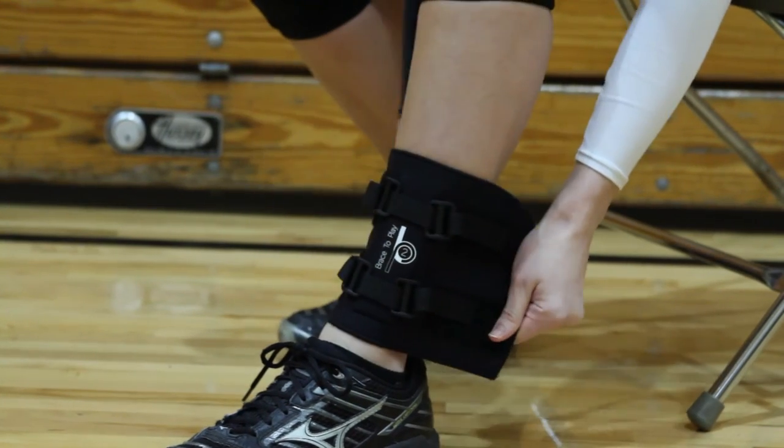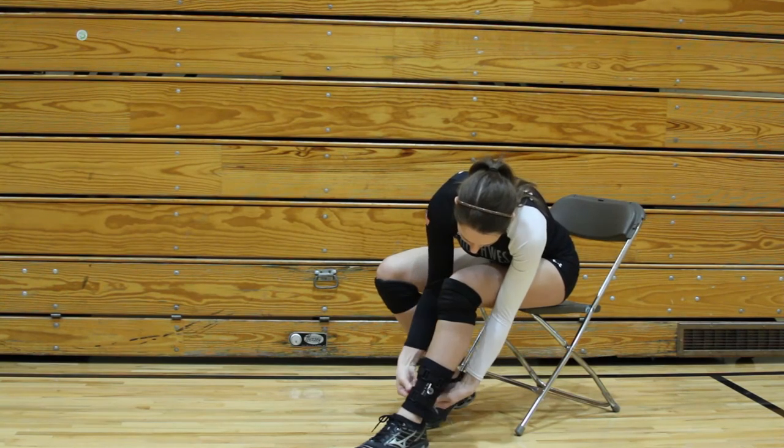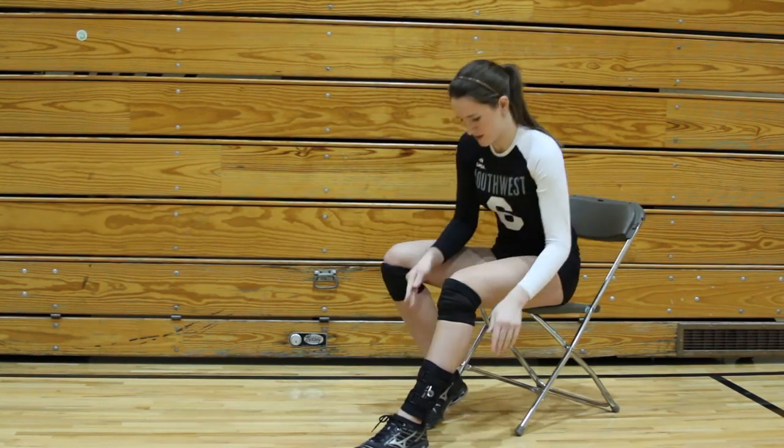If you sprain your ankle, that's not something that should take you out of the game and prevent you from coming back in. This allows the athlete to come back into the game and reach their full potential. It's very easy to put on — faster to put on by not taking all the loops out and tying it up. This allows you to put it on at a very fast pace and then also heal and get that movement back at a faster rate.